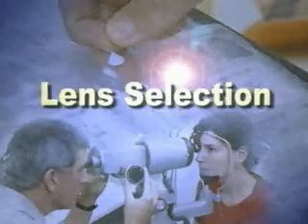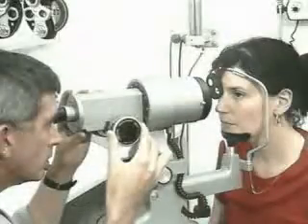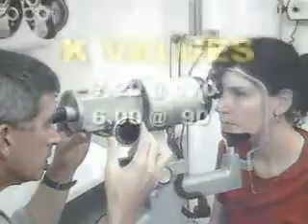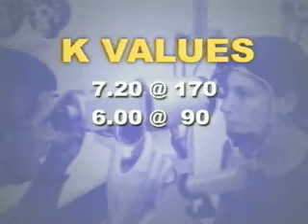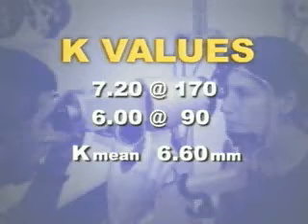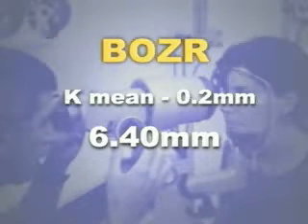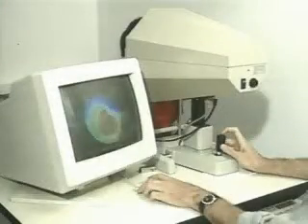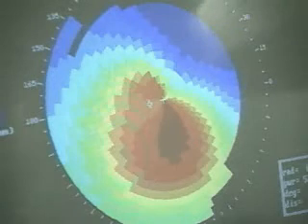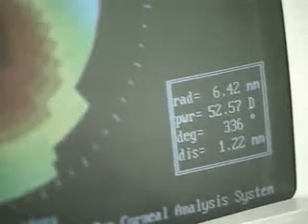Lens selection. Selection of the trial lens radius is usually based on corneal topographical mapping or keratometry results. For this patient, the keratometry values are 7.2 at 170 and 6.0 at 90, giving a mean K of 6.6 millimeters. The recommended radius for the first trial fitting lens is 0.2 steeper than the mean K. In this case, a 6.4 millimeter lens is fitted and evaluated. If a corneal topographer is used, the trial lens radius is dictated by the corneal curvature at the third ring on the horizontal meridian in the temporal quadrant.